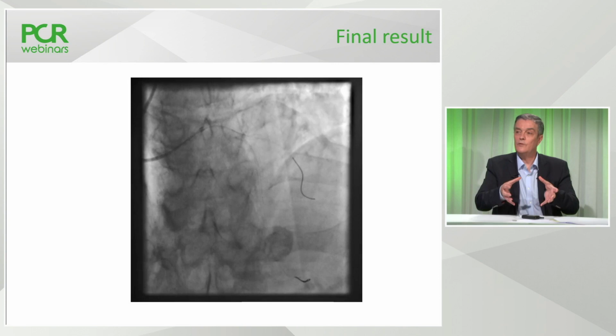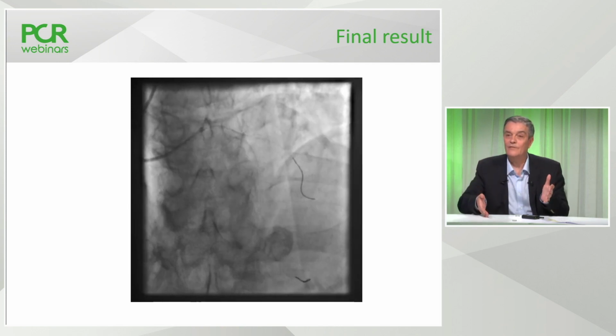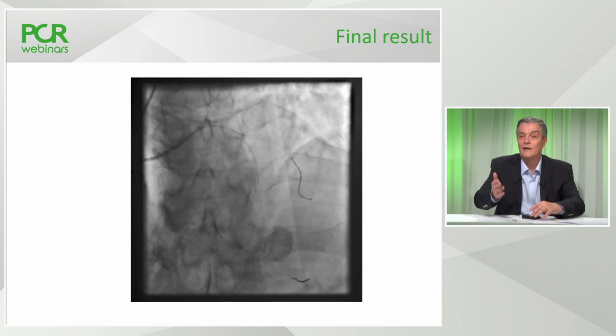Yeah, especially when you inflate two balloons simultaneously, which are big balloons, you have partial collapse of the proximal edge. Yes. And if we speak about final POT, it should be more proximal compared to the initial. Bernard, do you agree with that? You have some special comments?